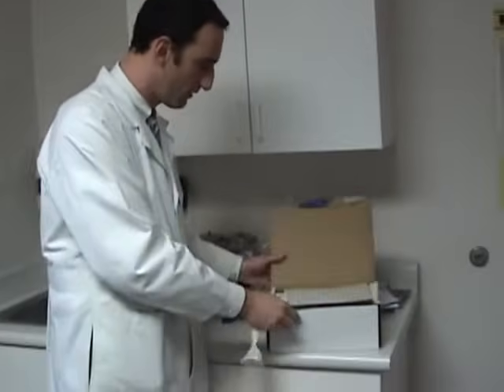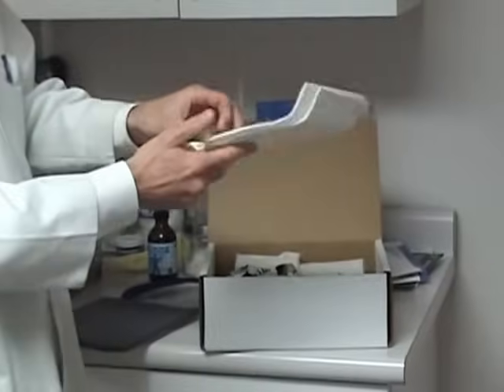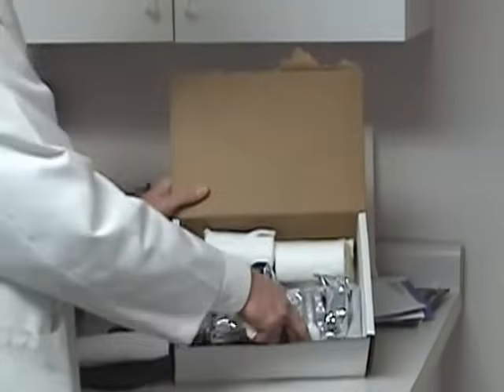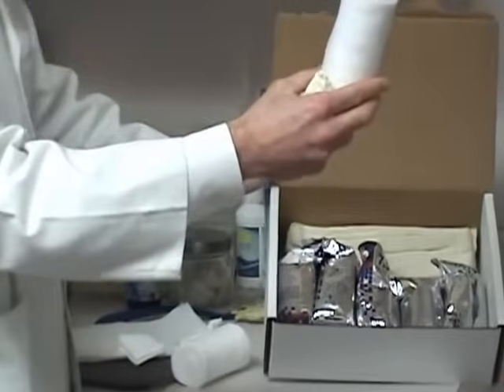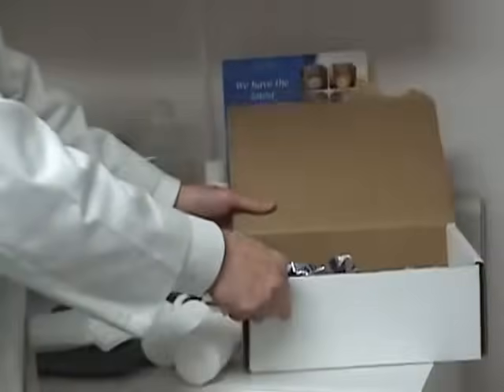We have a kit with all the things in it. There is padding for the toes, felt which we're going to use to offload bony prominences, gauze for between the toes, padding in the form of Webrel, stockinette, and our fiberglass. It comes all nicely packaged.